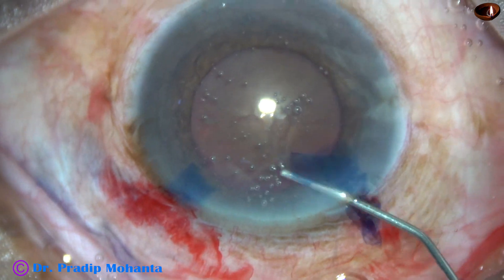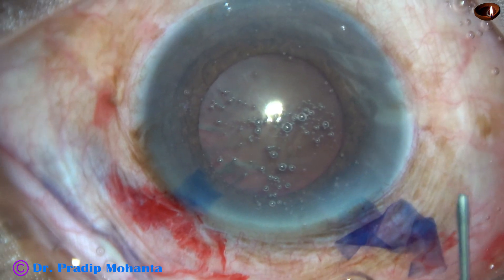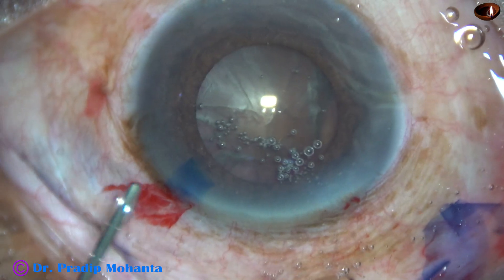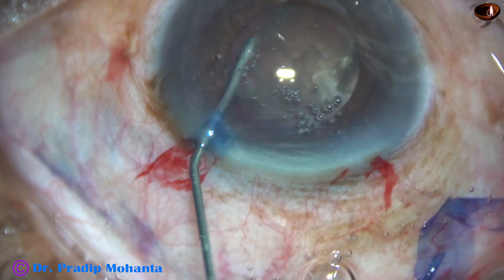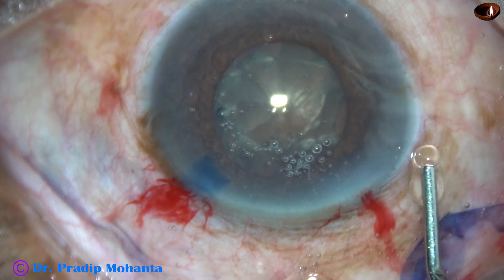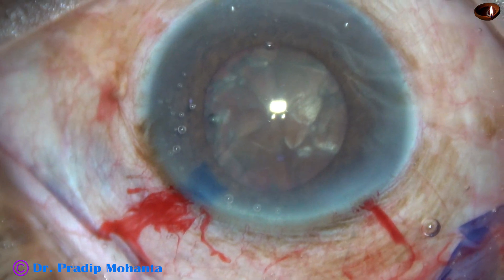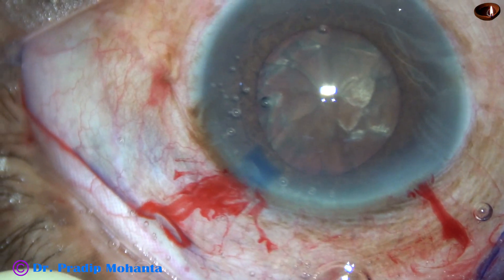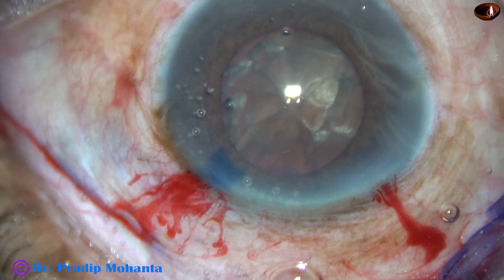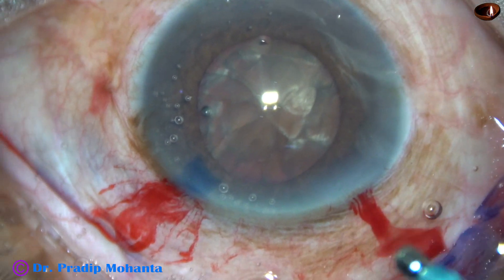An adequate-sized rhexis has been achieved by going almost along the border of the pupil. I am not sure whether I will need any pupil expansion device in this case, but if required, we have a BHEX pupil expander already in the operation room. Visco — this is 2% HPMC. You can use chondroitin sulfate first below and over the surface of the cataract you can use HPMC or sodium hyaluronate, but I use 2% HPMC even in these black and red cataracts.